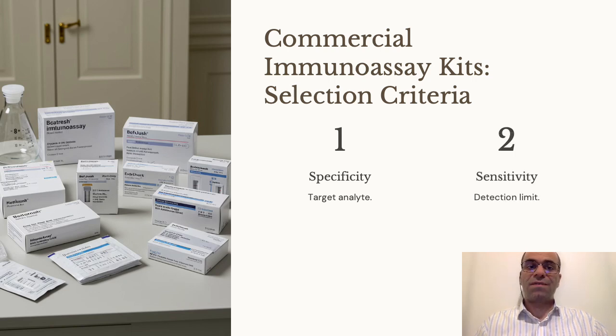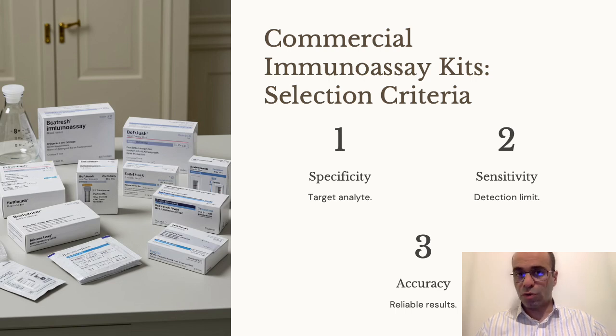Number two is sensitivity, the lowest concentration of analyte that can be reliably detected. Higher sensitivity allows for detection of trace amounts, critical in applications like early disease diagnosis or environmental monitoring. And the third one is accuracy. Accuracy is about the closeness of measured results to the true value. Accurate kits produce consistent, trustworthy results across multiple tests and different laboratory conditions, supporting confident clinical or research decisions.